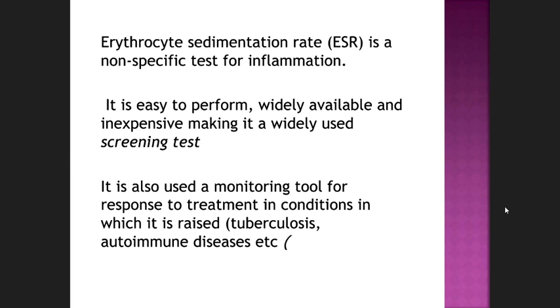So what Gaurav was telling is that the blood will clot. No, it won't clot because we're taking a tube which has an anticoagulant. And which anticoagulant? There are two anticoagulants, EDTA and citrate. If you take in different tubes, the methods are different and the values are different. So Gaurav, first of all, it's not coagulant. Blood is not clotting.